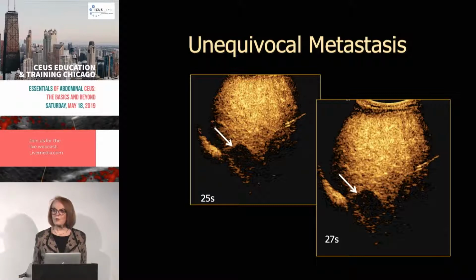Now, how often do we do scans like this kind of thing? Surprisingly often, and Richard had mentioned looking for metastases. What I feel about looking for metastases is this. If you consider the big cancers that our oncology departments are filled with, it's colorectal cancer, lung cancer, and breast cancer.